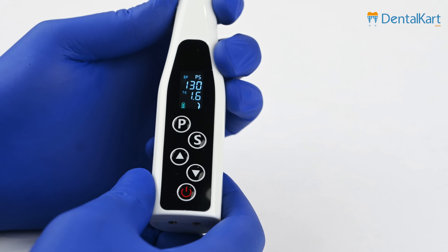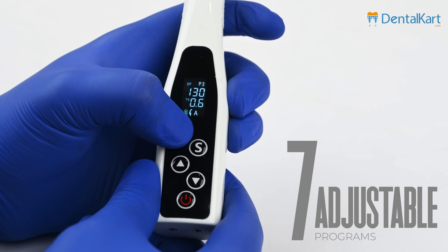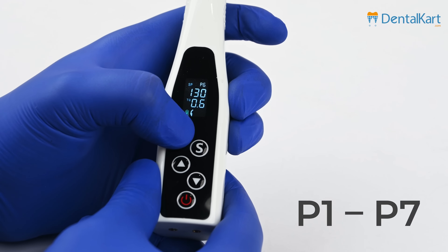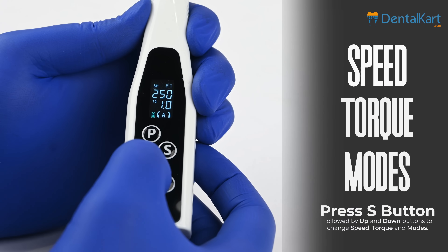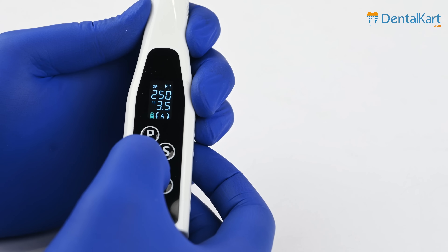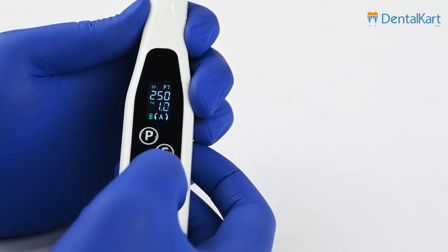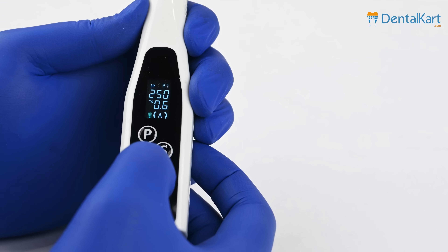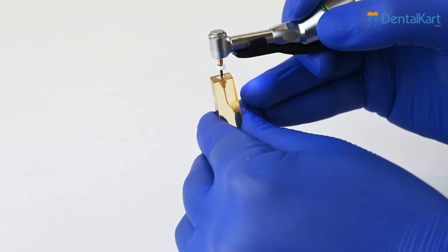Once powered on, the Endoking Cordless LED Endomotor is ready for use. It has seven adjustable programs from P1 to P7, providing practitioners with the flexibility to adjust speed, torque and modes according to their preferences and specific procedural requirements. This customization empowers clinicians to tailor the device to their convenience, enhancing overall efficiency and precision during endodontic procedures.